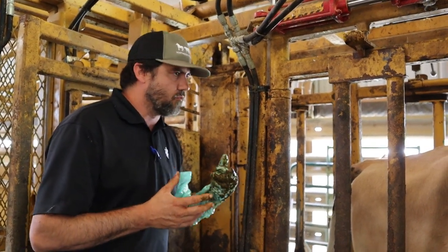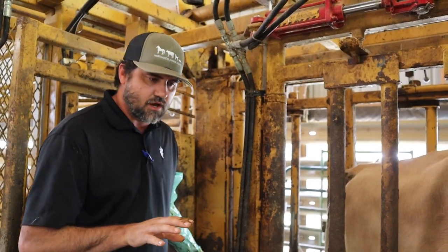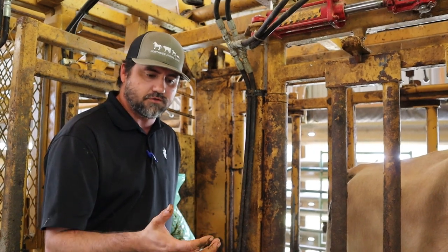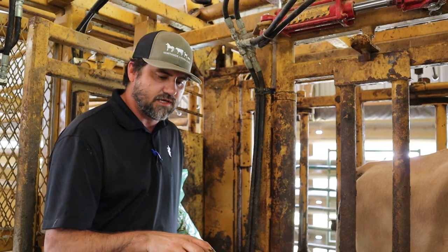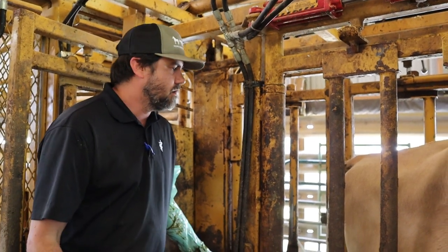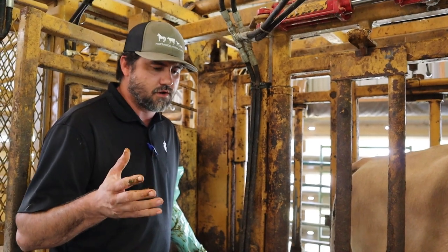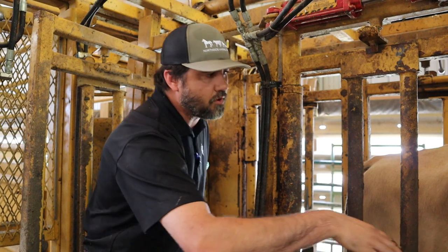In a normal cow that's open and not pregnant, I would be able to go in about wrist deep and feel the reproductive tract kind of grasp at my hand. And I could feel each uterine horn, the left and the right, right there. But then as the baby grows, the fetus goes over the pelvic brim into the deeper part of the abdomen.